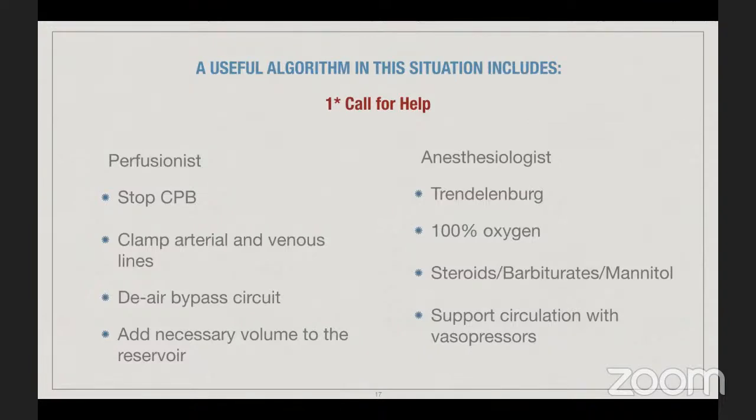One of the safety measures that is being done by some of our colleagues is that before they use the vent, they put it in saline and ask the perfusionist to turn it on, and they check if it is sucking or if it's bubbling.